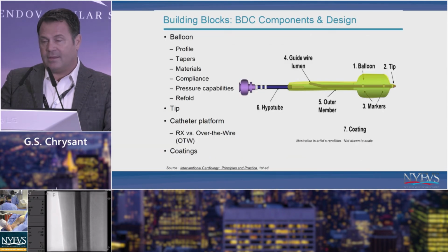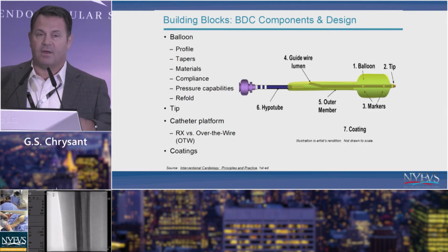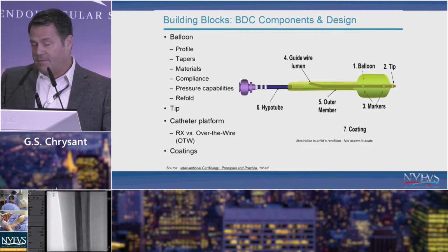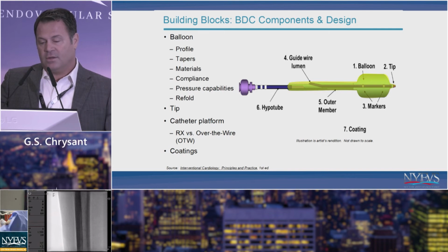In terms of PTA, I think there's also characteristics that are important, understanding how these balloons work in terms of their crossability, in terms of how they unfold and how they refold, and not being in a hurry. These are areas where you want to take your time, do a very long, slow, methodical inflation, because unfortunately we don't have a lot of fantastic stuff below the knee in terms of length. We don't have the ability to put long DES at this point. We don't know if BVS is going to work. So because we're using balloons, we need to know how to use them.